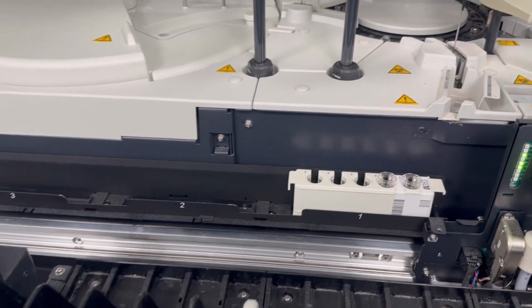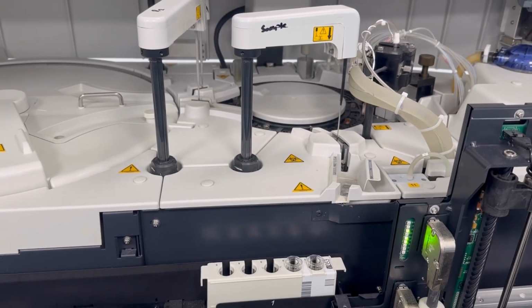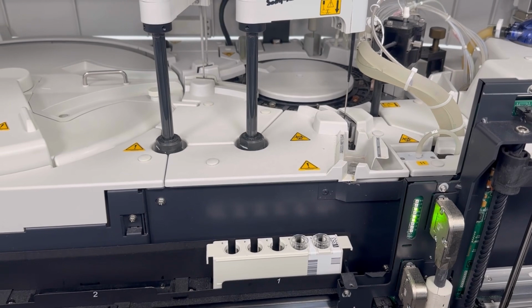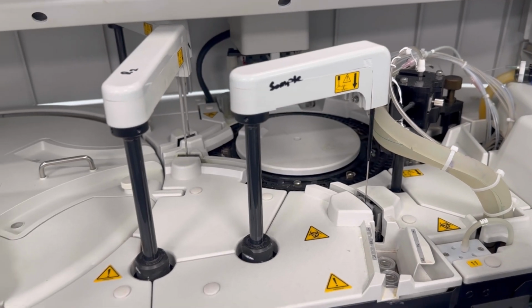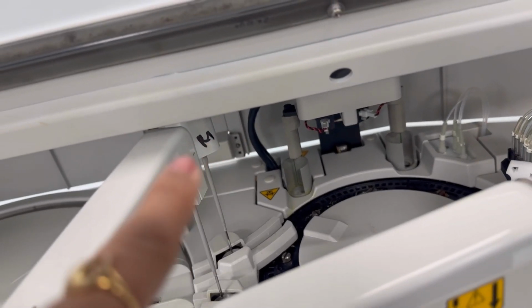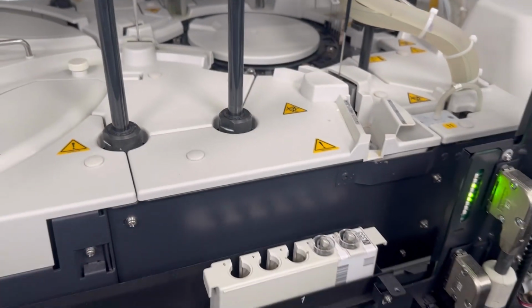As you know, just now I have shown you the biochemistry reagents. Always we have R1 and R2, the code of the biochemistry reagents, for every biochemistry reagent, R1 and R2. So here you can see the probes. Probes are nothing but a kind of this one. This is the probe from where the sample will get aspirated. The machine will aspirate the sample from the probes only. So here we have the sample probe, R1 probe and R2 probe.